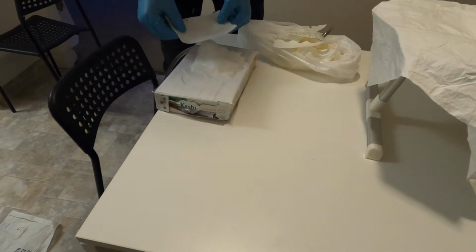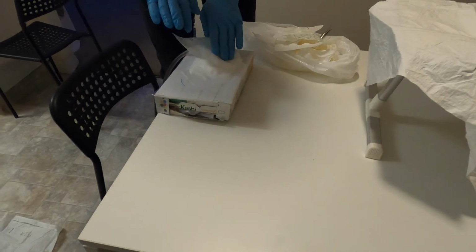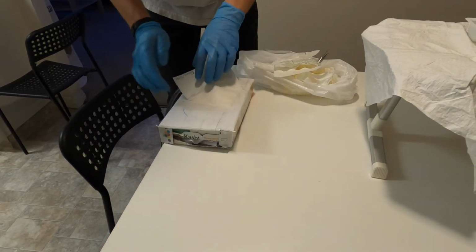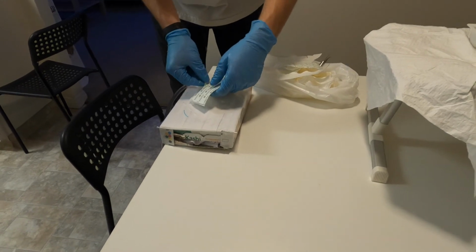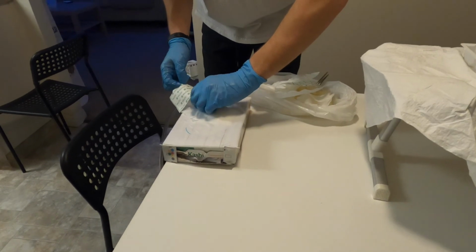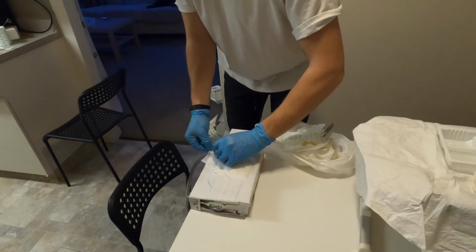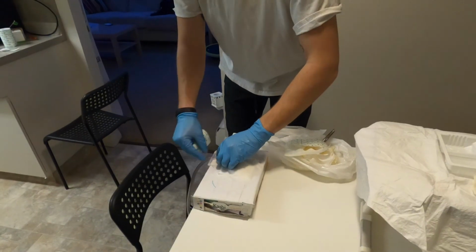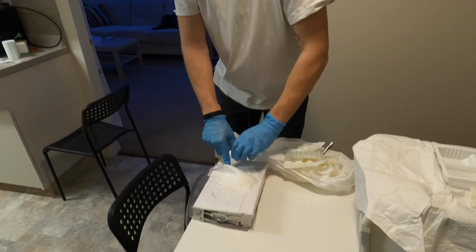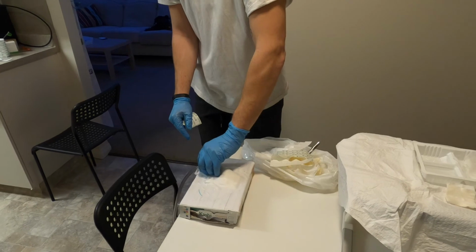Okay, I can go like this, just overlap here. Like so. And then with this other portion, I'm going to make sure to tent around the chest tube. Like so. It's a little folded over on the top there, but the important part is that it's tented and secured right next to the chest tube, which it is.